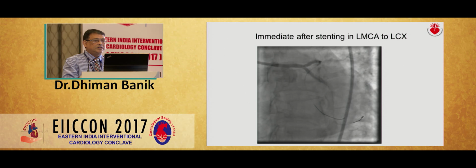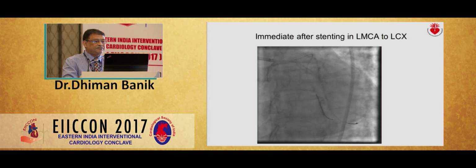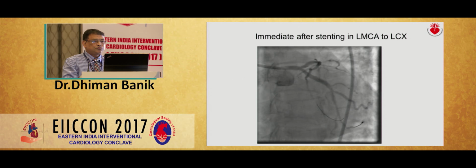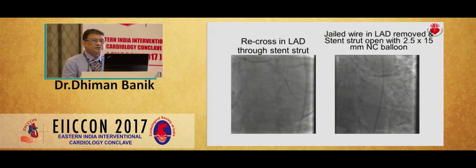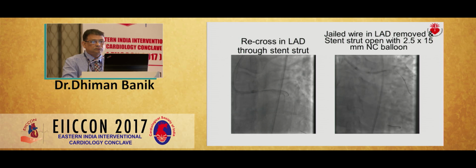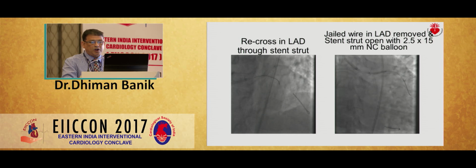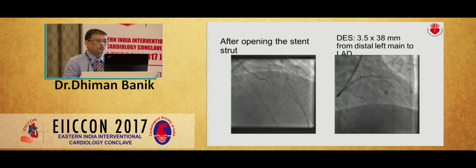Immediately after the stenting of the left main to LCX, the ostial of the LAD seems tapering. So I recrossed the LAD through the stent strut. Then the jailed wire is taken out from the LAD and the stent strut is opened with a 2.5 by 15 millimeter NC balloon. After opening of the stent strut, this looks like this.